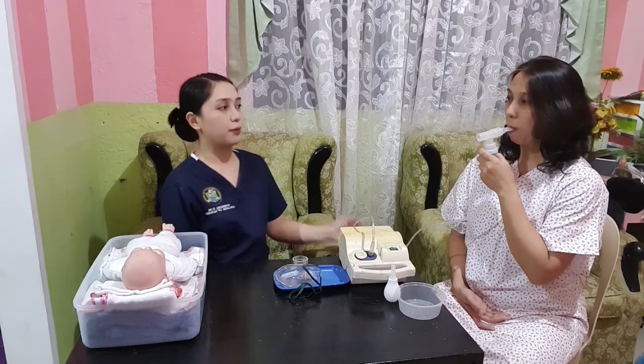Okay, thank you ma'am. If the patient is dyspneic, encourage the patient to hold every 4th or 5th breath for 5 to 10 seconds. And then remind the patient to perform proper breathing technique until the drug is completely nebulized. So this maximizes effectiveness of medication.